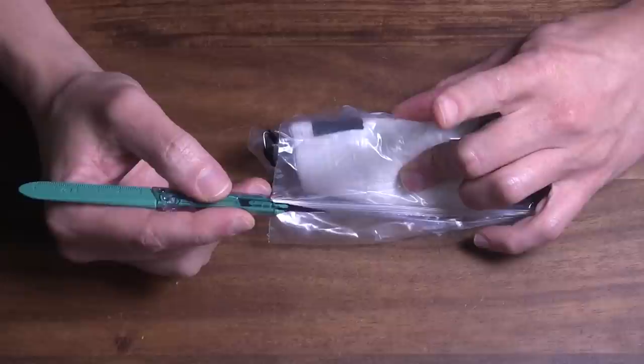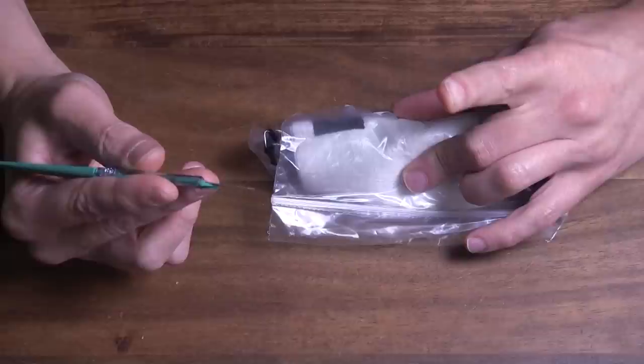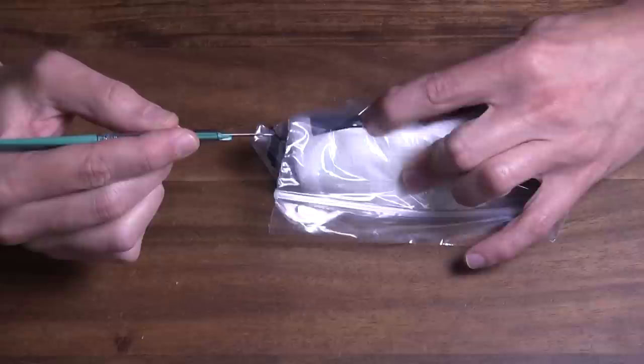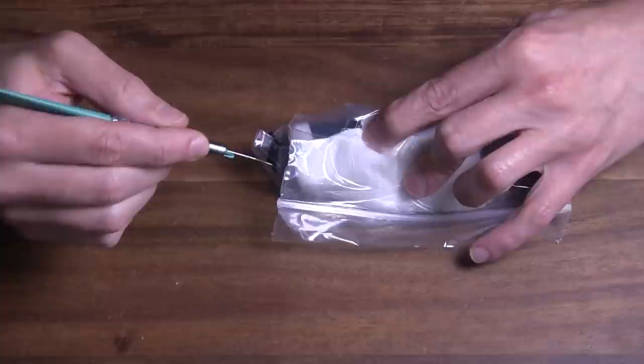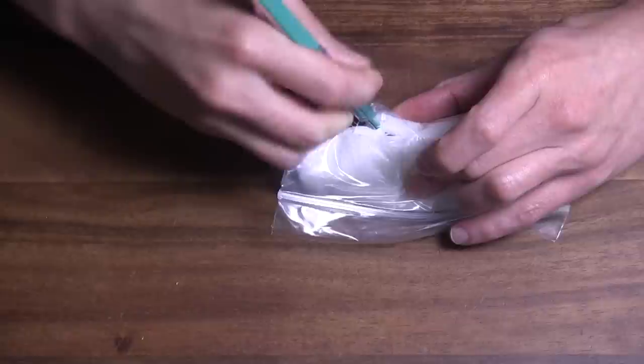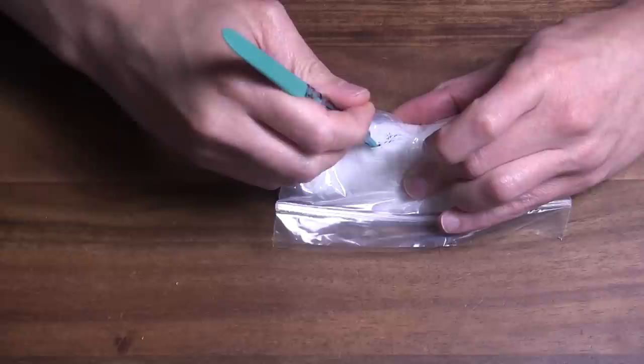So fingers down, scalpel's away. If scalpel is going to come in, finger goes up. I'm going to make a vertical cut about inch and a half, and I'm going to repalpate. Okay, I know where I want to go here. I can feel enough that I'm right down to membrane. So at this point, finger points to the ceiling, puncture in, pull all the way towards me, 180 degree rotation, all the way away. Scalpel comes out before the finger goes down. Nothing's disappearing here.